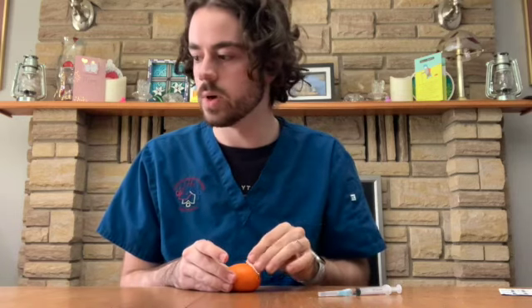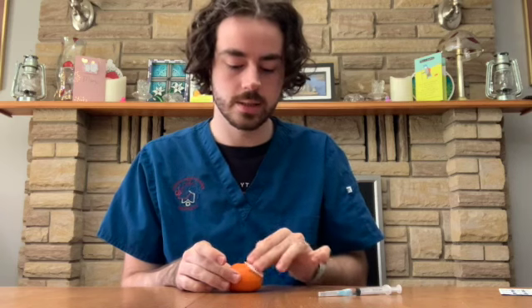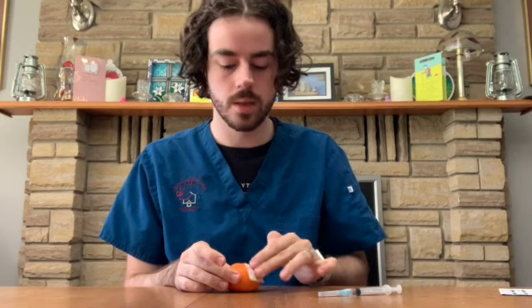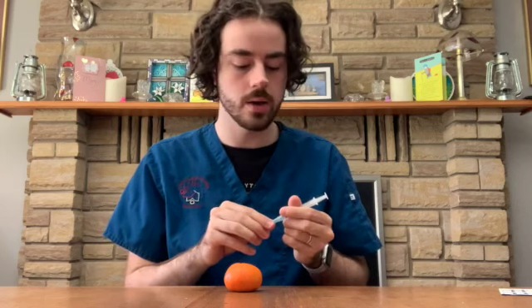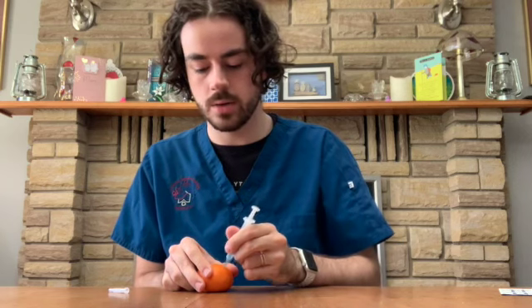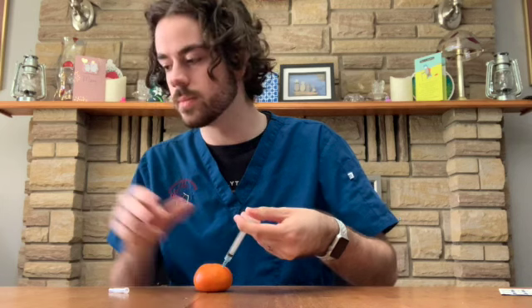and then I can cleanse the injection site with an alcohol swab. Again, I'm going to be doing it for 30 seconds. I won't do a full 30 seconds just for the video. And for an intramuscular injection, instead of pinching the skin, I'm actually going to pull the skin apart. So I'm going to pull the skin taut, and then I'm going to administer it at a 90-degree angle, holding it like a dart. Then I can administer my medication.